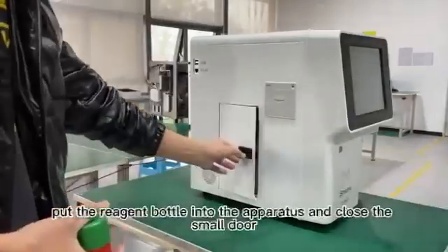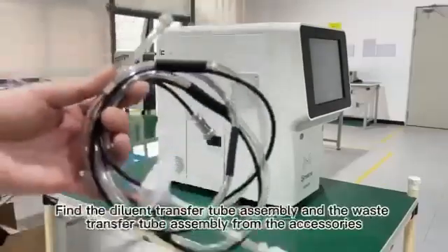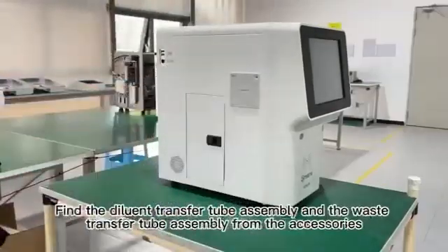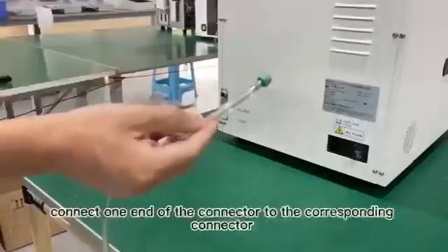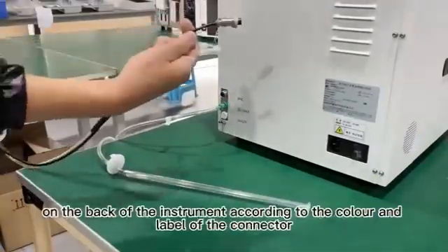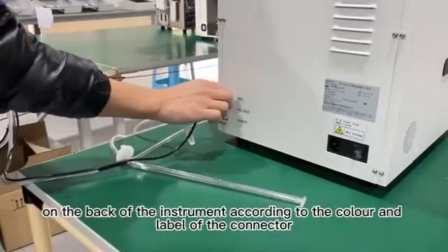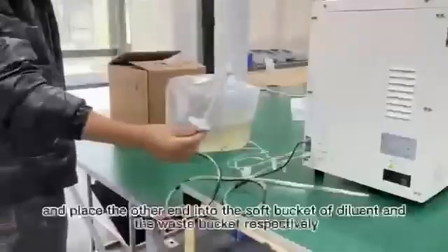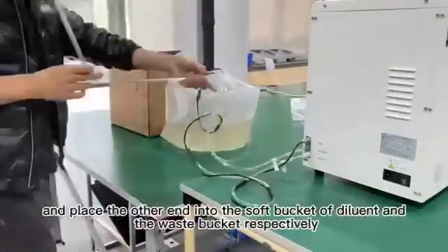12. Put the reagent bottle into the apparatus and close the small door. Find the diluent transfer tube assembly and the waste transfer tube assembly from the accessories. 13. Connect one end of the connector to the corresponding connector on the back of the instrument according to the color and label of the connector. 14. Place the other end into the soft bucket of diluent and the waste bucket, respectively.